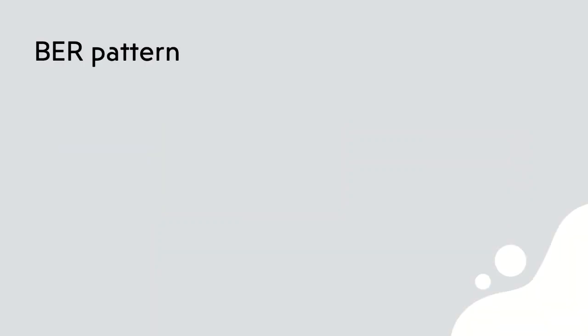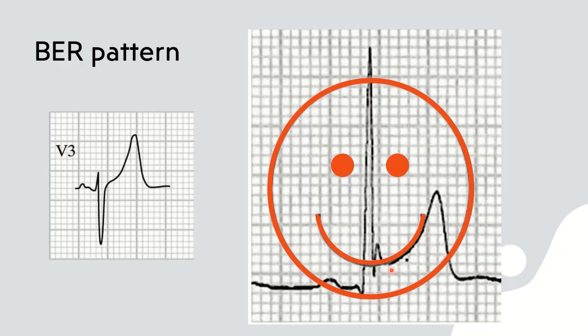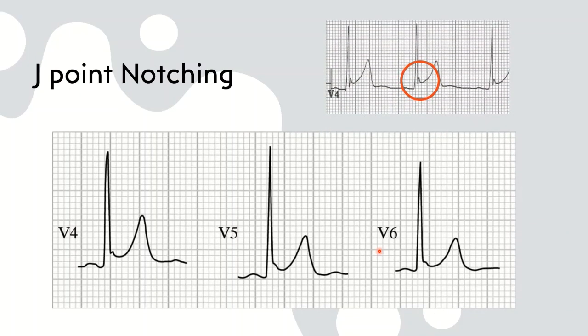Now what's the benign early repolarization pattern? You see it is like half of a smiley face. So this ST elevation takes a concave shape which almost represents half of a smiley face. So let's look for benign early repolarization and just note this notching of the J point. Like I said, the notching of the J point. You see there's a notch here, there's a notch here, there's a notch here. So the notching of the J point is quite important.